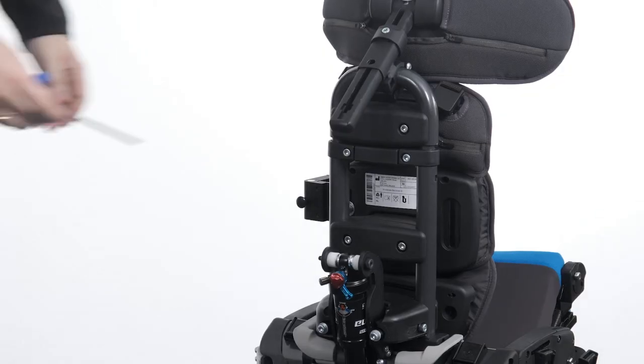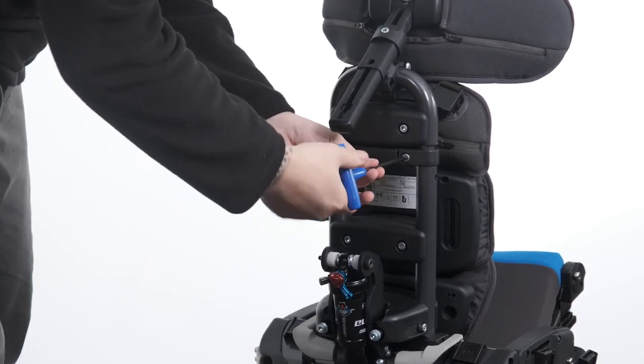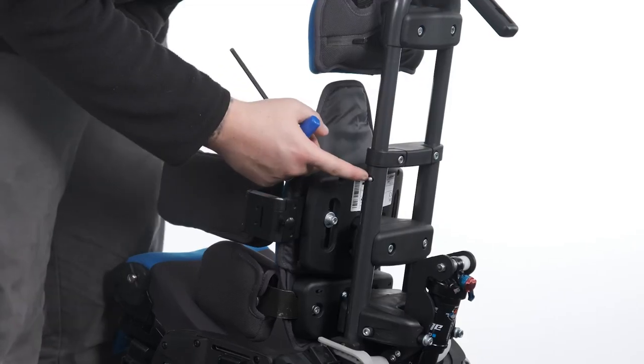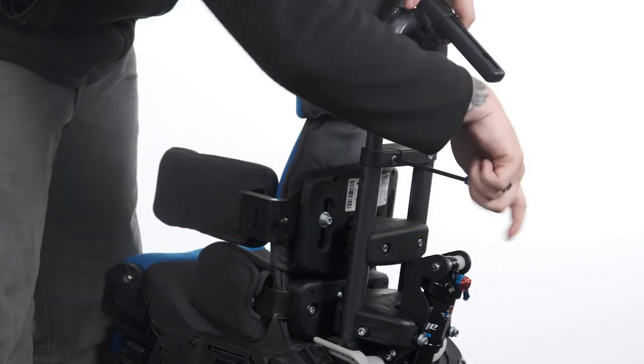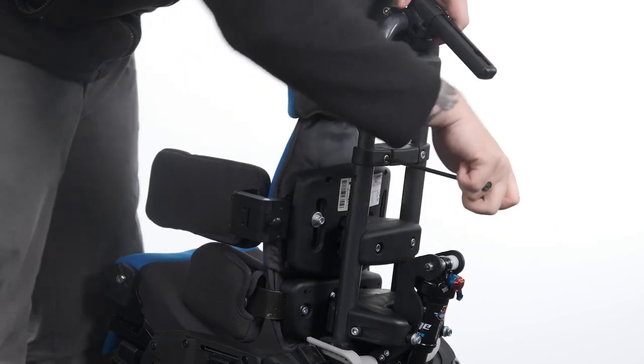Adjusting height of backrest. To adjust the height of the backrest, loosen the bolts of the backrest height adjustment clamp and raise or lower the backrest telescoping tubes to the desired height. To adjust the backrest down from the highest position, press in the snap fastener at the side of the tube and push downwards. Tighten the bolts of the backrest height adjustment clamp to secure in position.